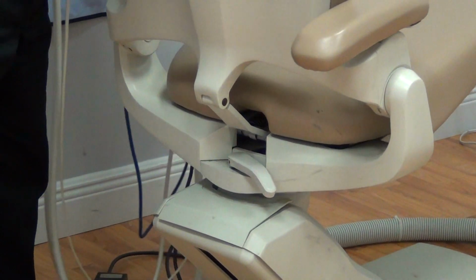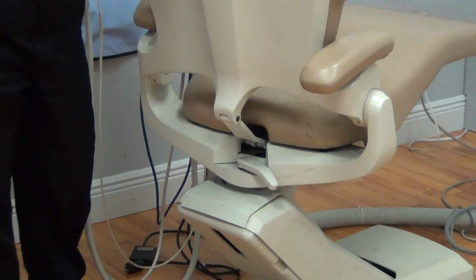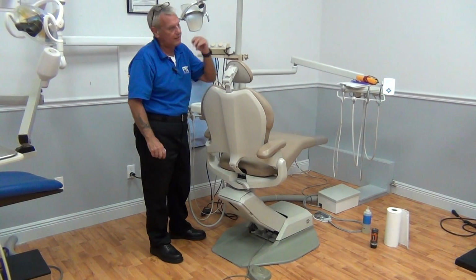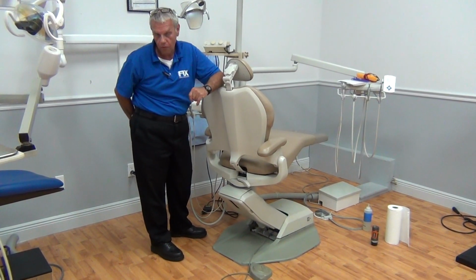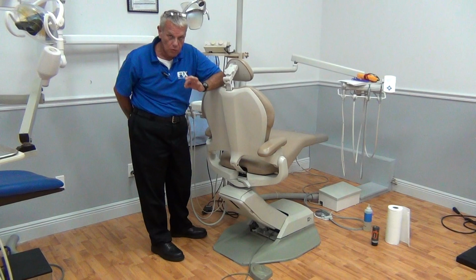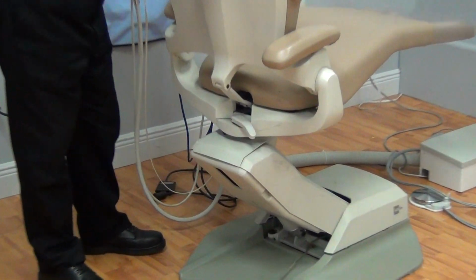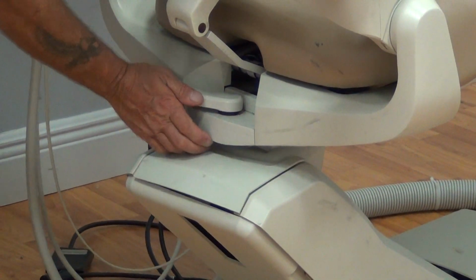Now before you go turn it on the chair, guys, again, be aware of your environment. Check your walls. Make sure you're not going to scuff your walls or tear up your drywall, bang the delivery system that's attached to the chair into the wall, or knock a tray off the wall. You want to be quiet and you want to be professional. We've determined we got freedom of movement. Now we're going to lock our swivel back down securely.